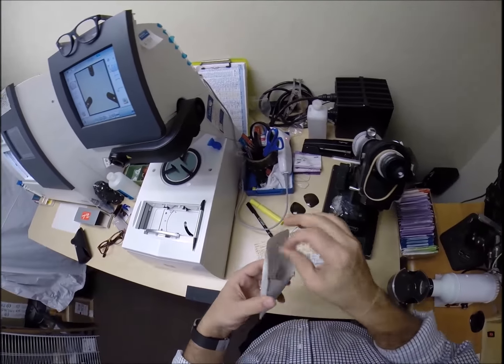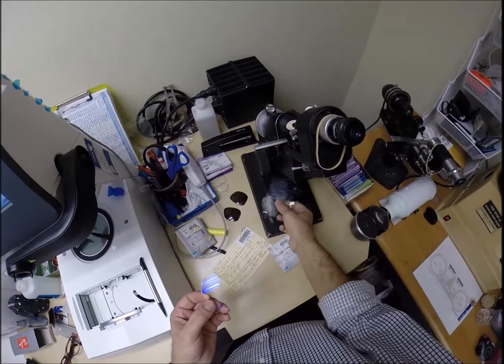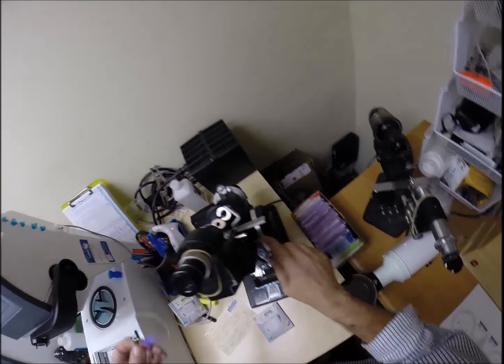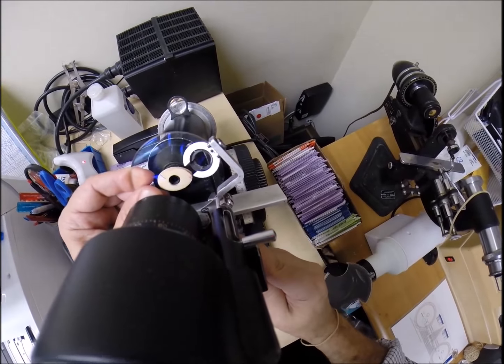And take the lens out of the protective sleeve. It comes with a little laminate on the front of the lens. I'm going to stick that on there for my collection. How many of these lenses have I cut? And that's going to go into the recycling bin. Put the power drum on minus 75. Put the lens in, rotate until the spherical power comes in clearly.